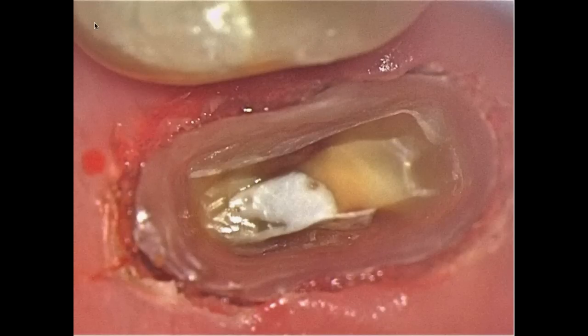And as you know, if you try to tell a patient to move his head to the right, it will take about 20 seconds and he will keep his head straight again. They always tend to keep their head in the middle of the pillow and the middle of the seat or chair they are lying on. So they don't really go out of focus.